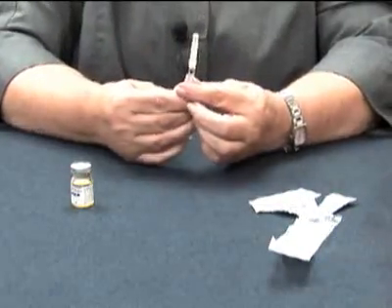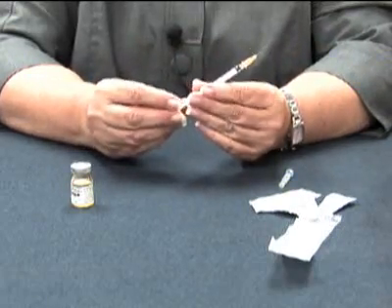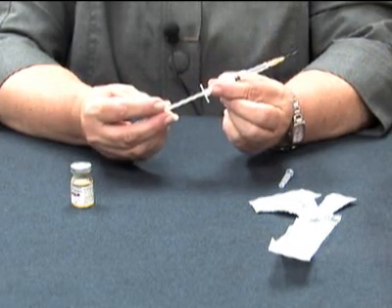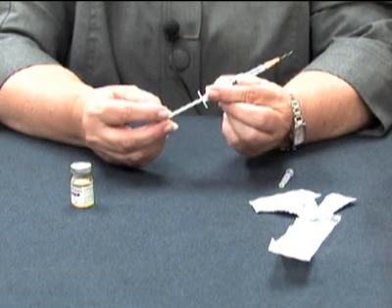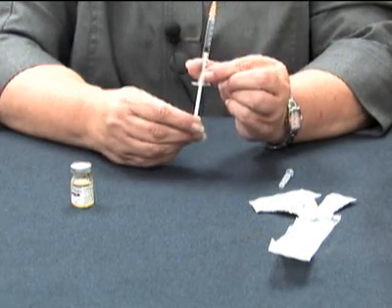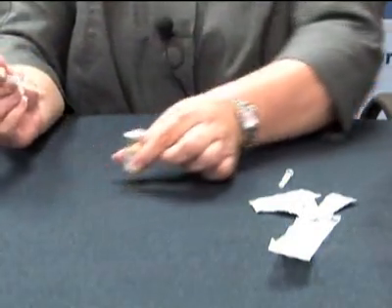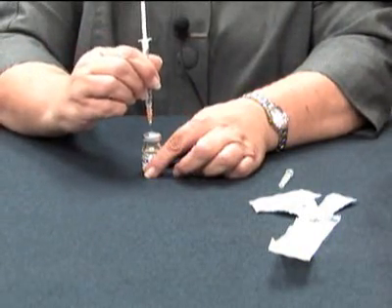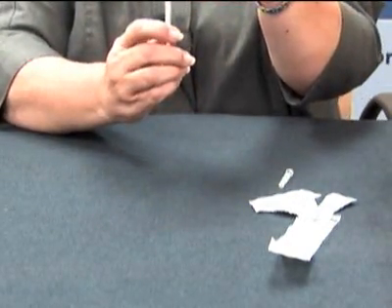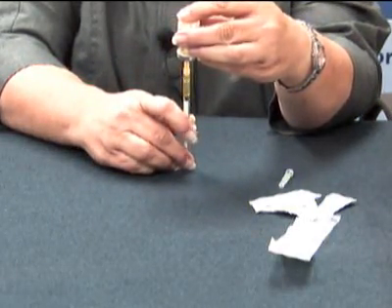Next you are going to take your syringe and remove the cap. Your prescription will tell you how much methotrexate you need. What you will do is pull back on the plunger to the specified number. For example, if I am going to take 0.5 cc's of methotrexate, I would pull my plunger back to where I see 0.5. I inject the air into the methotrexate bottle, turn the bottle upside down, and withdraw the methotrexate until I reach that 0.5.